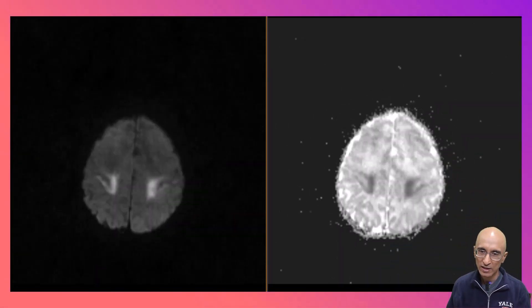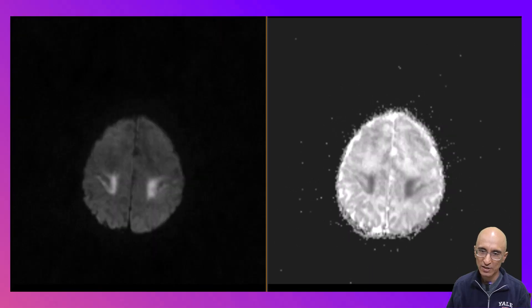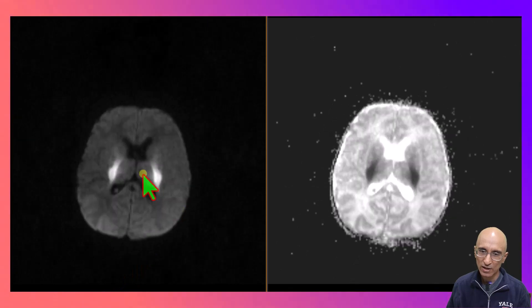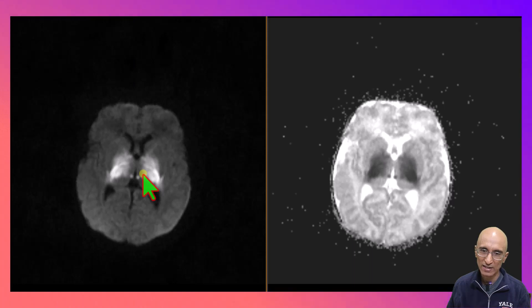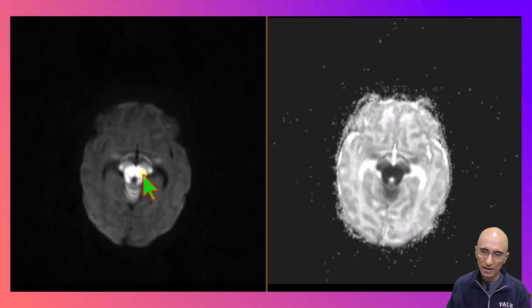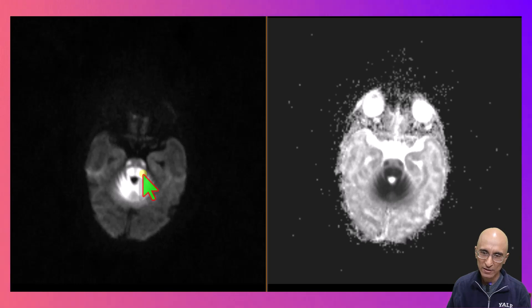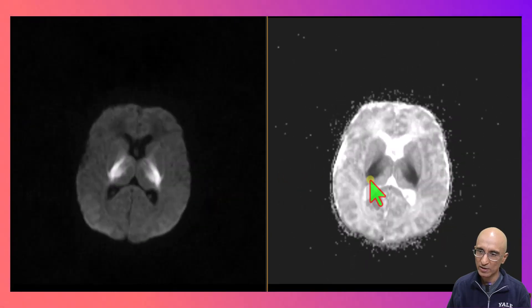On the diffusion weighted imaging we can clearly identify restricted diffusion in the perirolandic region along bilateral corona radiata, extending into the basal ganglia regions including the globus pallidus and thalamus. In the brainstem you can see restricted diffusion along the corticospinal tracts along the dorsal aspect. You can also see marked restricted diffusion in the cerebellum, with corresponding ADC signal in all these regions.